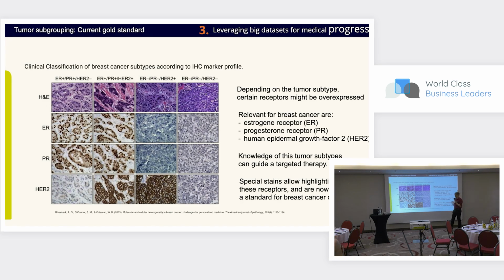If we look, for example, into the diagnosis of breast cancer, what you typically do at the moment is that you do not get only this kind of tissue. This is, of course, stained, dyed with some chemicals that make it look purplish. You will typically also take the tissue and use some other dyes, and these reveal some characteristics of the tissue, for example, if it has strong estrogen receptors in it. This gives you some clues about how to treat that cancer properly, so you can much more efficiently target it.